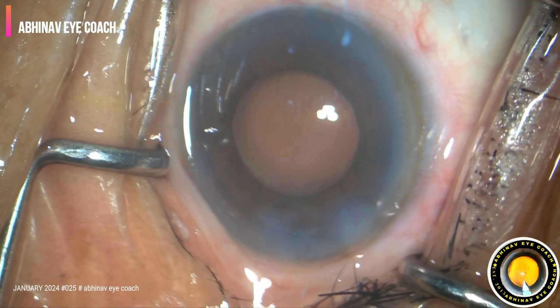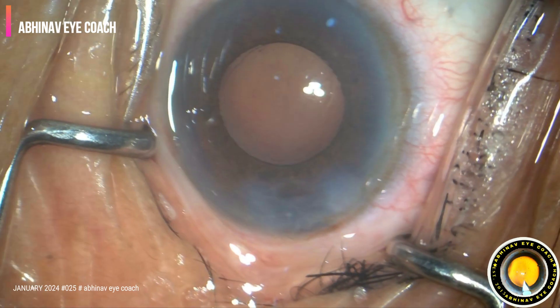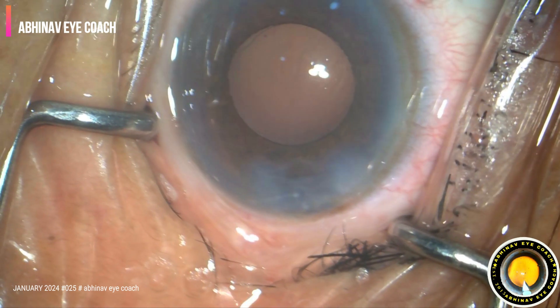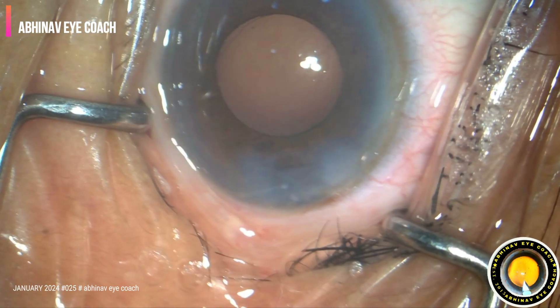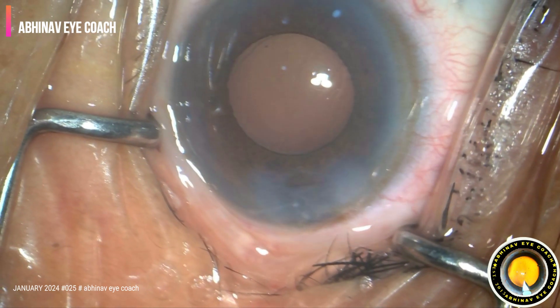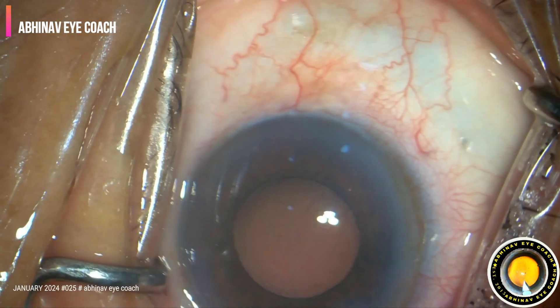Planning for IOL implantation. Probably I am loading the lens or my assistant is loading the lens, so a little bit of delay. There are a few eyelashes in the field. Eyelashes are draped very well, but you should always take care of that — there should be no eyelashes or eyelid margin exposed.